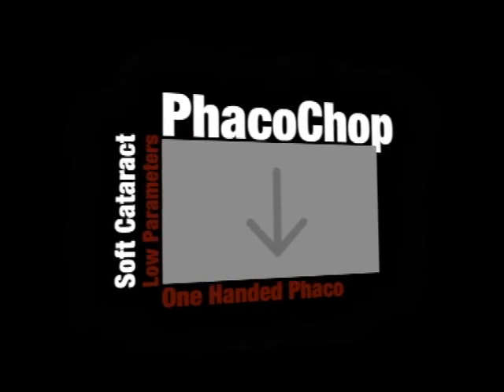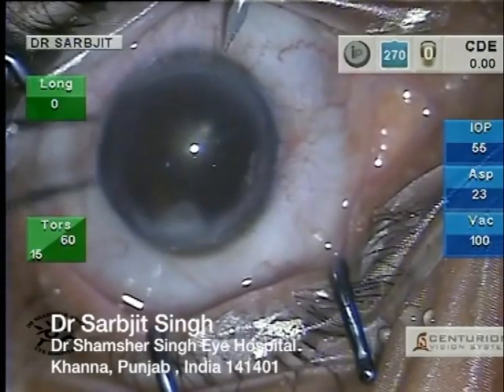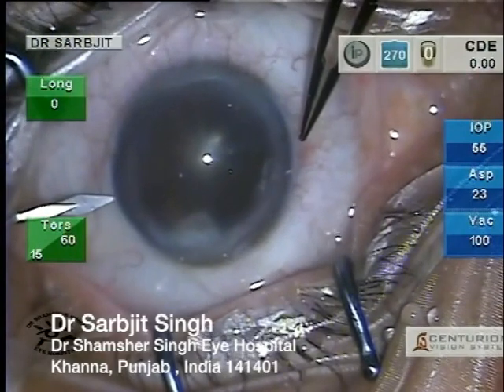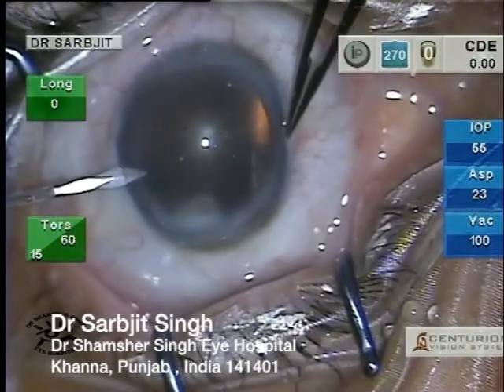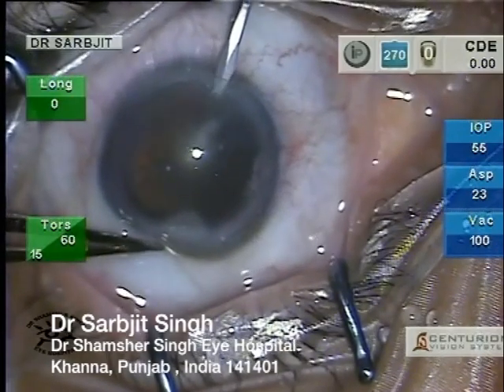Hello everyone, today I shall be showing you a video of phacoemulsification in a case of soft cataract, which we all know can be more difficult to do than some harder ones. I do two side ports in my cases.